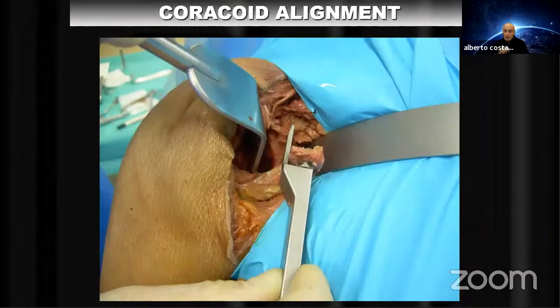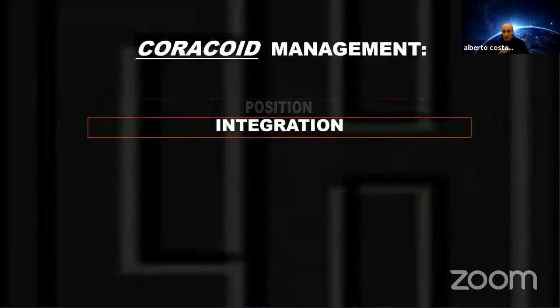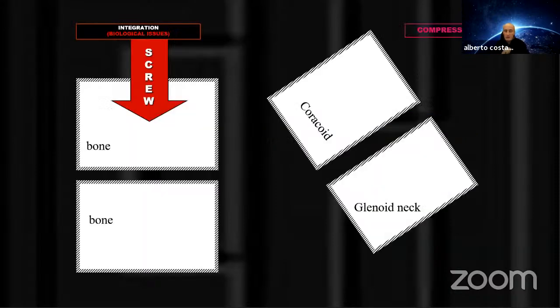I use this device because, as you see, it gives me this offset, the distance between the margin of the glenoid and the margin of my bone graft. This is important to avoid a position too much lateral of the graft. Once we have decided about the position, the problem of the Latarjet is the integration.